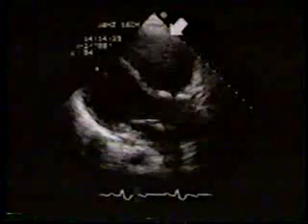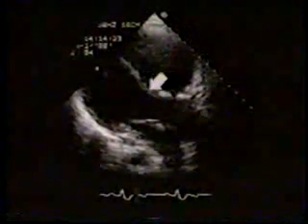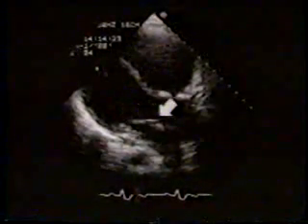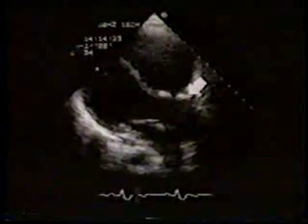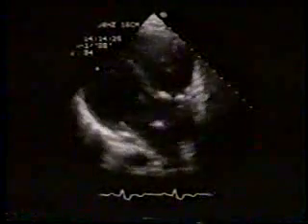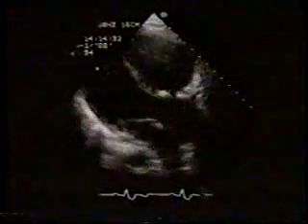Note the other findings. The right ventricle is markedly dilated and the left ventricular size is normal. Mitral and aortic valves are in this position. Observe these features in real time and you'll note that the septal patch is intact except for the dropout in the mid portion.